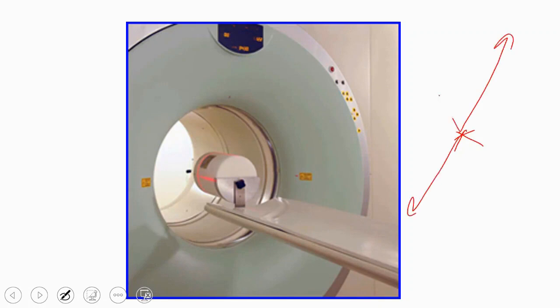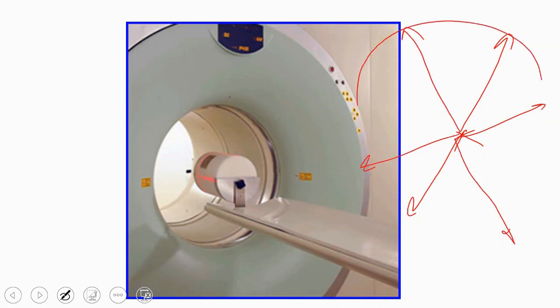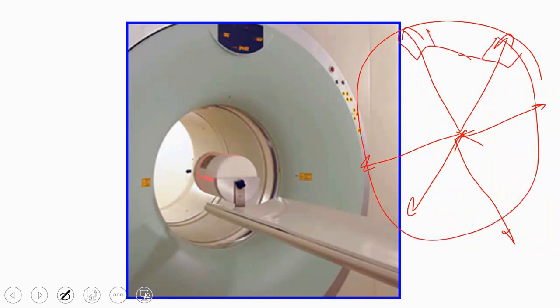For example, you are using a point source. This point source emits gamma photons in all directions at 180 degrees. The crystals are located around you, and these crystals begin to create an image of this point source. Here, there is no attenuation, nothing at all, but this image is referred to as a reference. This reference tells you about the detection, or what I call the line of response.